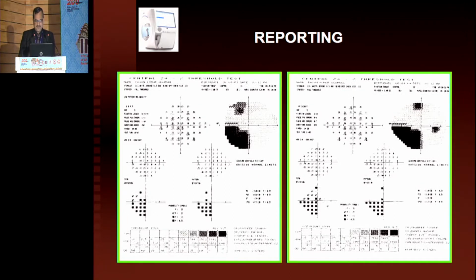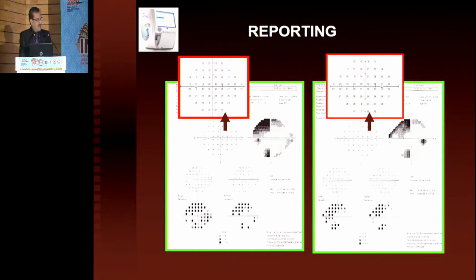So now, having understood that, I stopped looking here, I started seeing here. This is a classical superior arcuate defect, and then when you go to the Greytone chart, you see a definite vertical split. And if you see 0, 18, 0, 20, that means there is a definite neurological split, plus there is a possible early arcuate suppression.